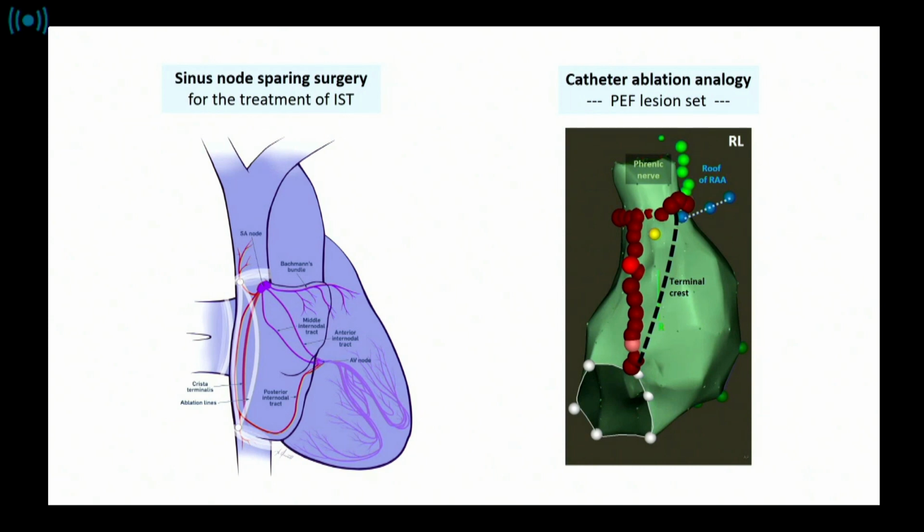First, there is no risk or almost no risk of creating the phrenic nerve damage compared to when this modification is done by radio frequency in past years, which was almost abandoned, this radio frequency procedure. And the second benefit, in my opinion, is that pulse field ablation causes only temporary suppression of vagal innervation to sinus node, because this effect is always associated with radio frequency ablation and definitely is counterproductive during ablation, because you do 2 things.